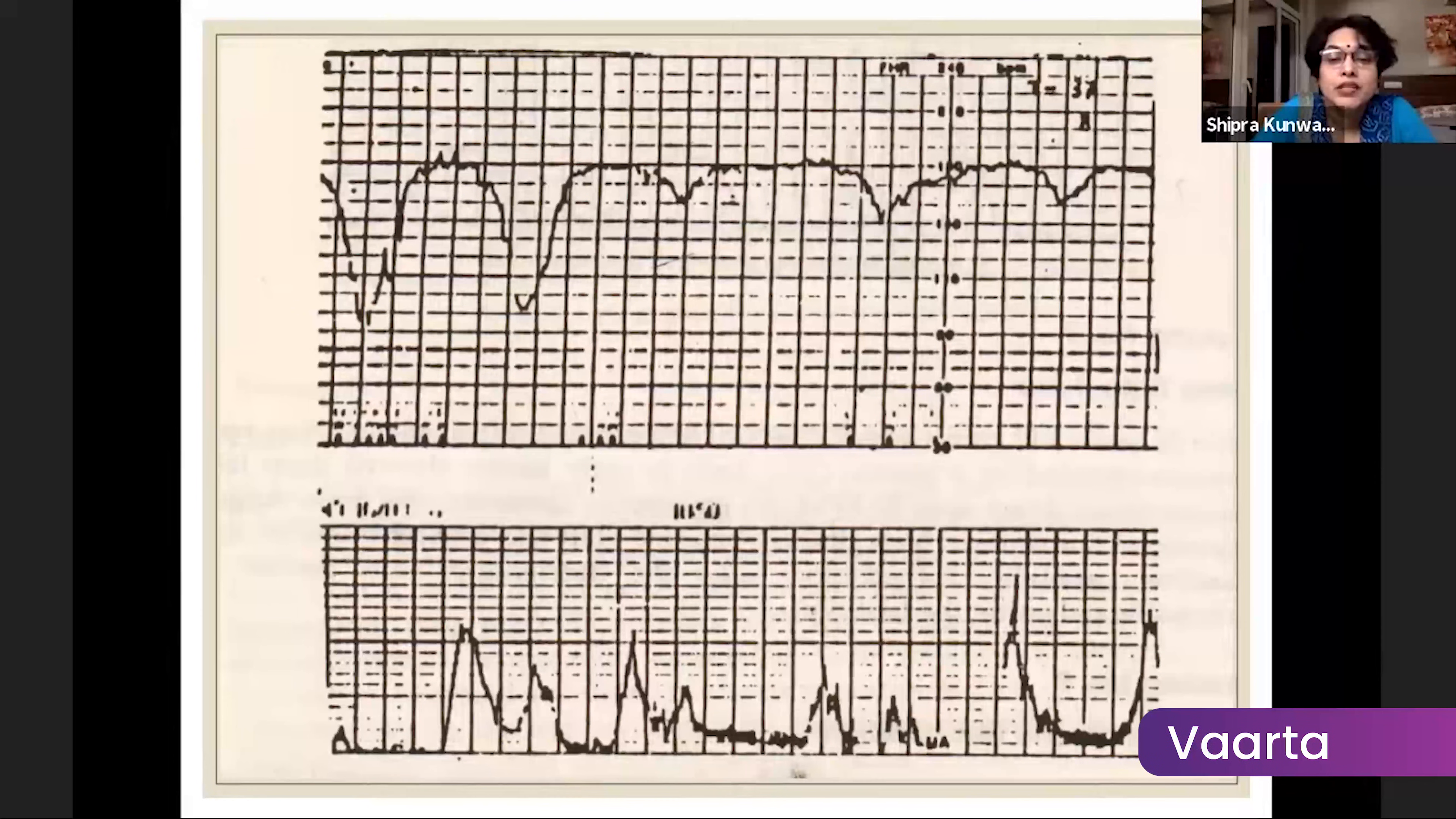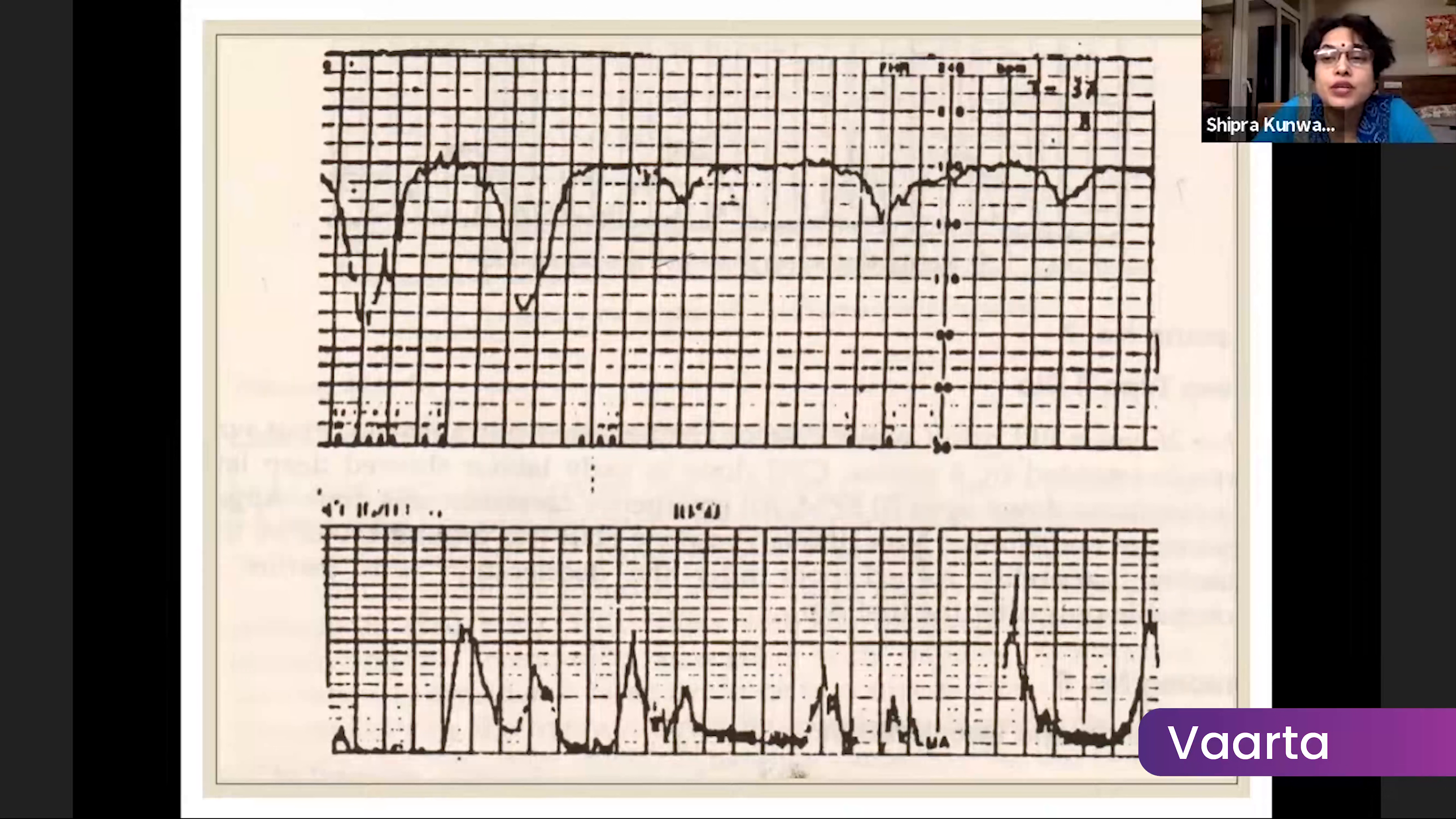These are variable decelerations and the variability is reduced. There are no shoulders, so it is a pathological CTG and we need to re-examine the patient.